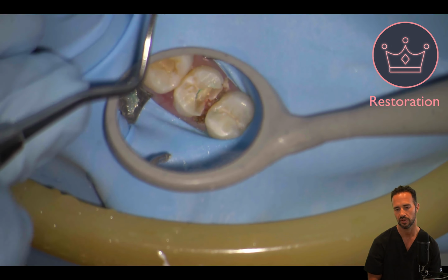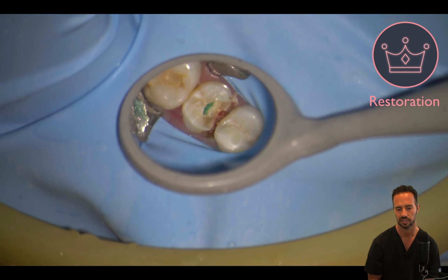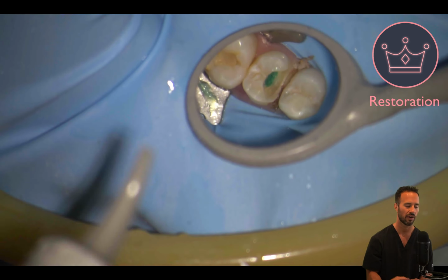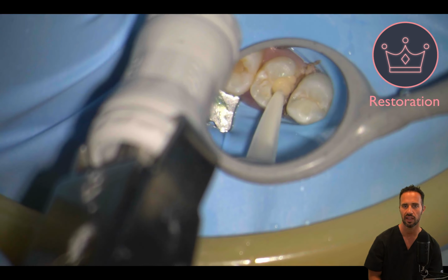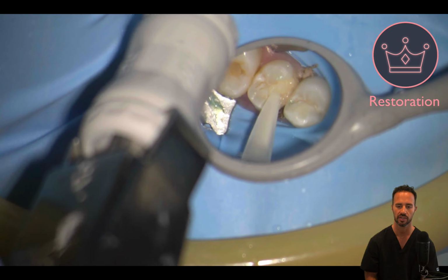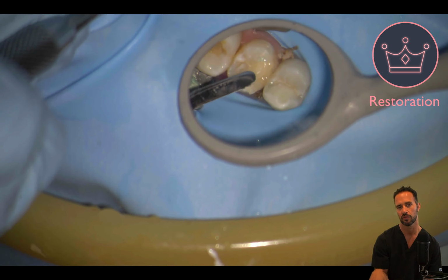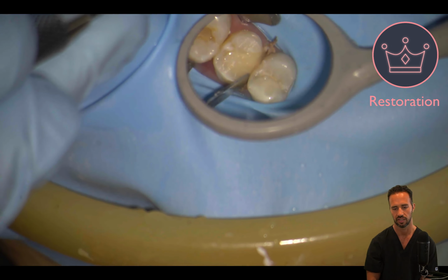Sometimes when you remove the opal dam green, you're going to have a little bit of bleeding from the gingival tissues. That's still inflamed, obviously. So in this case, I went ahead and used the System B again just to get that nice dry area to work with, so that my temporary restoration is being placed into a nice dry field. So I'm placing my Fuji 9 glass ionomer here on top of the sterile sponge, and I wanted a nice hard temporary restoration, and so that's being put into place. And then I'm using my Glick in order to give that provisional restoration some shape. All right, and that looks good.